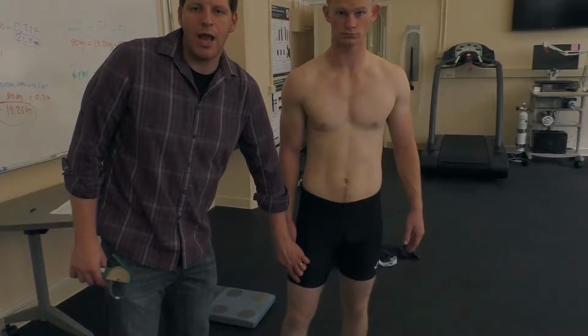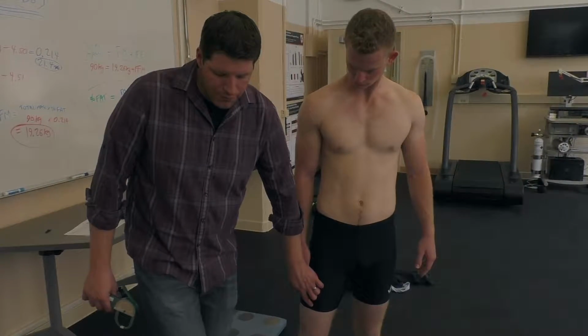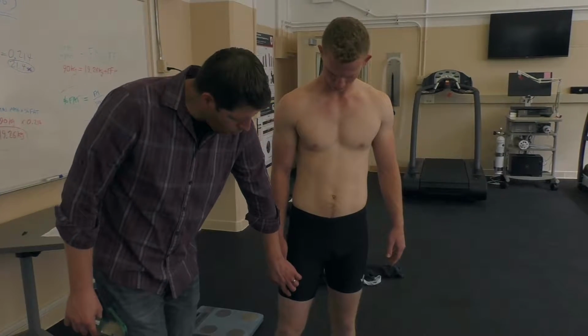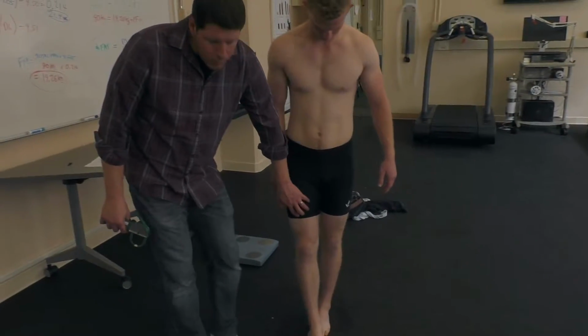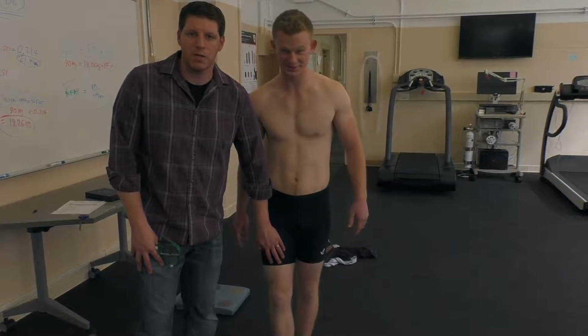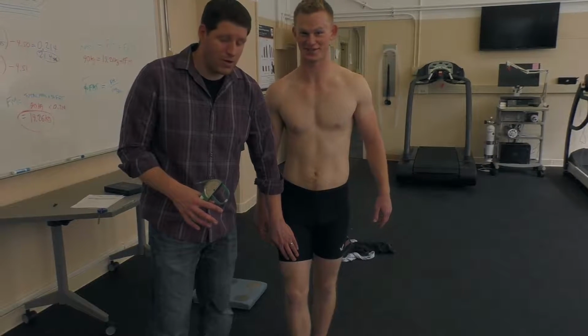And the one thing you're going to want to ask them to do when you're doing a thigh skin fold is to place their right foot on their left. So just the heel of their right foot on their left. So go ahead and do that. Because when we stand, we don't think about this, but when we stand, we're actually flexing that muscle. And it makes it... You have a hard time standing there? I'm not good at balancing. You're not good at balancing.